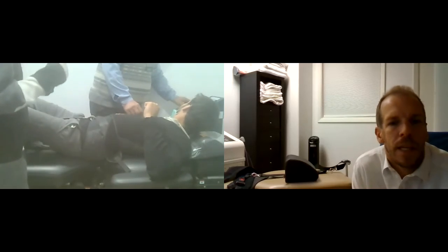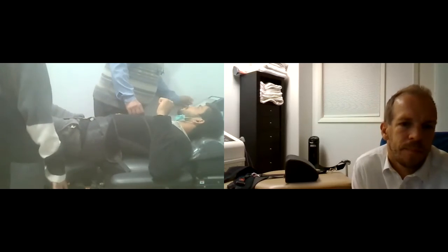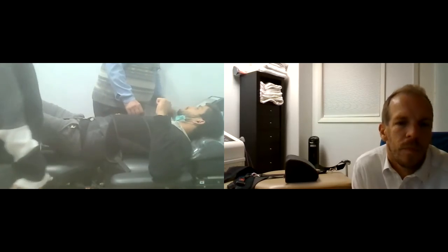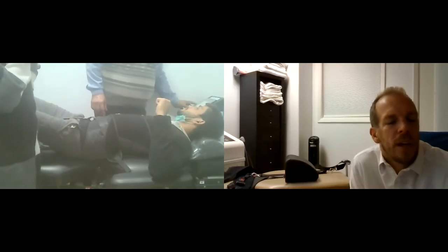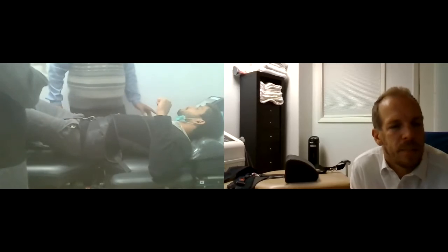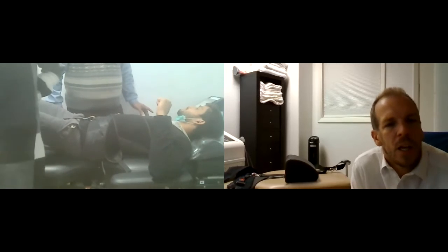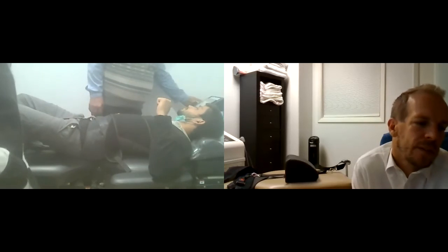Now, what does your estimated cycle time say? It says 14 minutes. So if we do 1 cycle on this protocol, that's a 14-minute treatment. Hit treatment cycles again and put in 2 cycles.